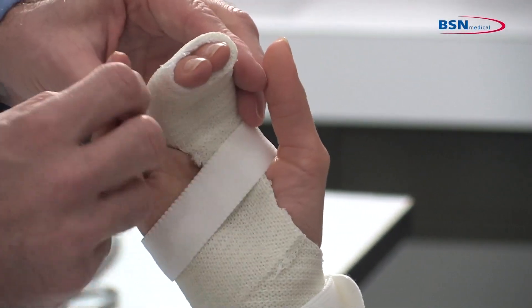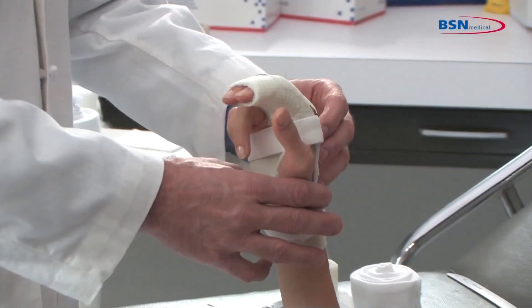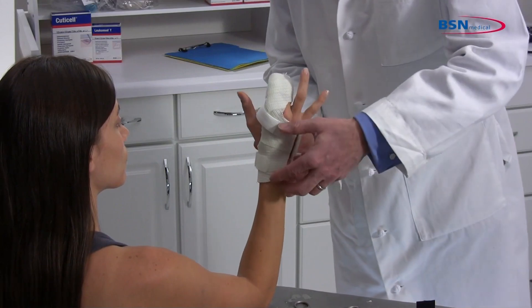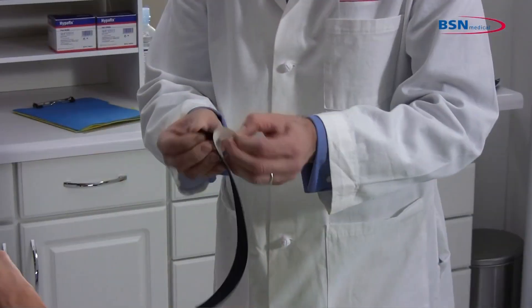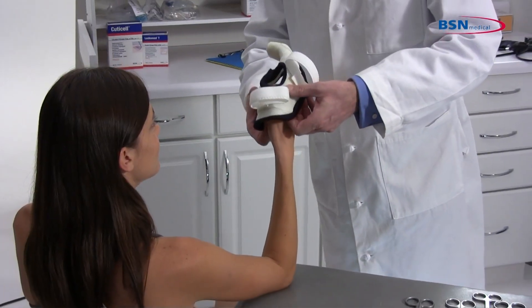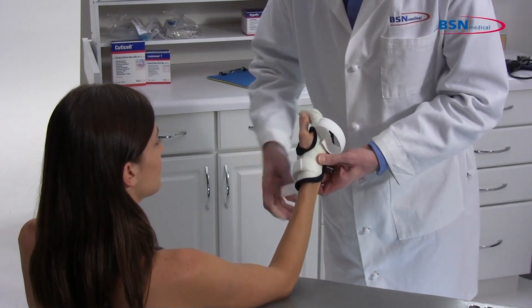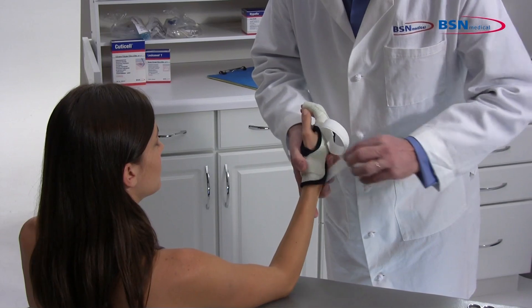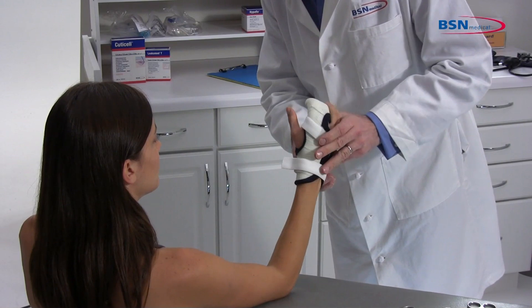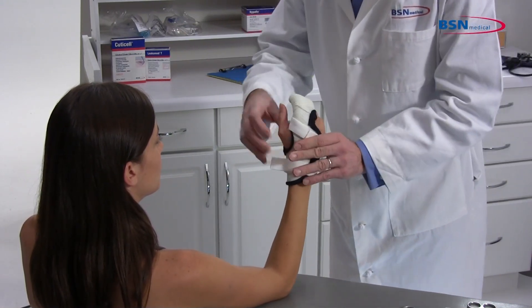Check any points that may cause irritation or pressure points and check mobility. Remove the cast and apply adhesive fleece edger to the edges of the cast and around the thumb. Fold the edger so it overlaps the edge and covers the inside and outside of the cast at the edges. Cover all edges that will come in contact with the patient's skin, creating softer edges. Put the finished cast on the forearm and close using the stretch loop. And you are finished!